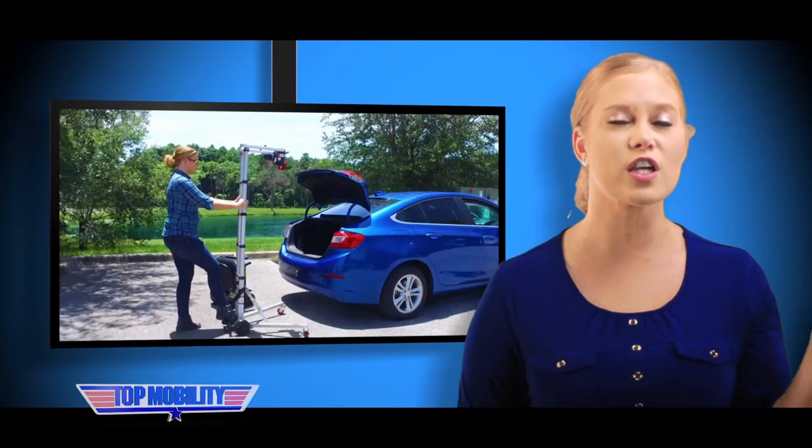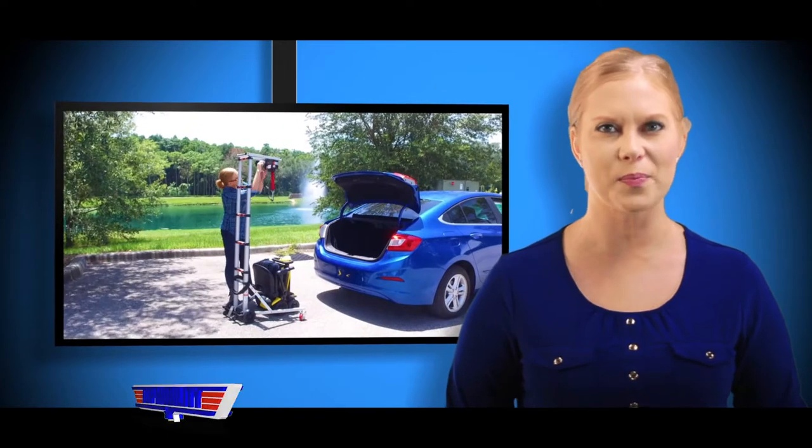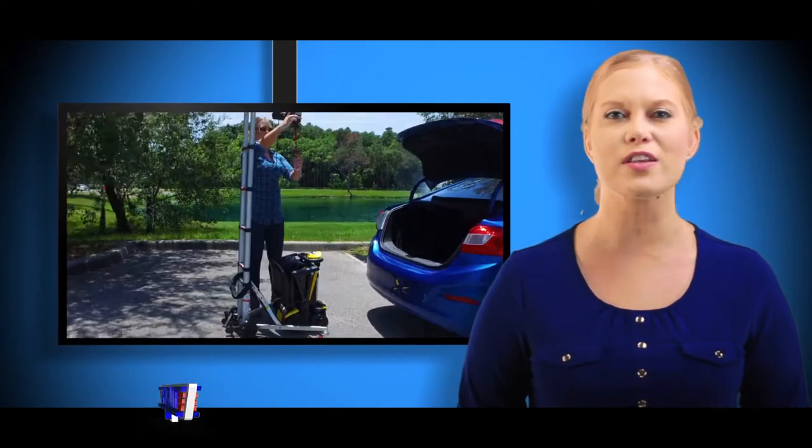Simply unfold the unit, raise the telescopic ladder, connect the power cable, and secure your scooter with the clip. Once you hit the switch, the Hercules lift does all that heavy lifting for you.